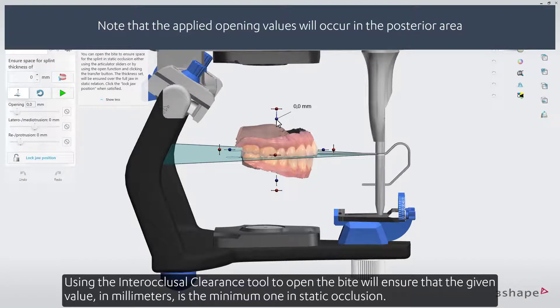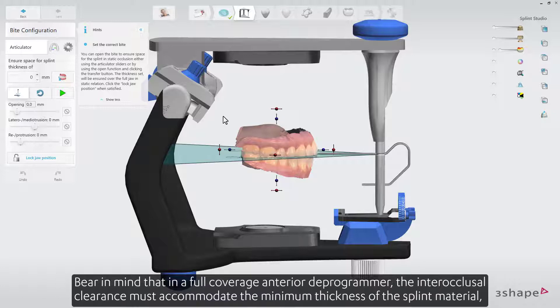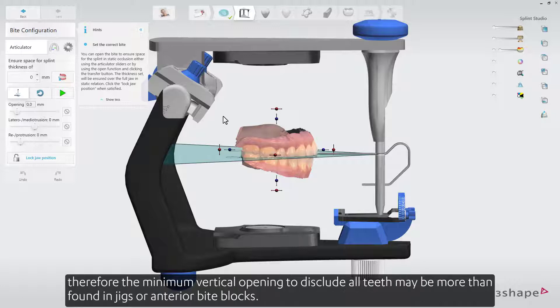Using the interocclusal clearance tool to open the bite will ensure that the given value, in millimeters, is the minimum one in static occlusion. Bear in mind that in a full coverage anterior deprogrammer, the interocclusal clearance must accommodate the minimum thickness of the splint material. Therefore, the minimum vertical opening to disclude all teeth may be more than found in jigs or anterior bite blocks.